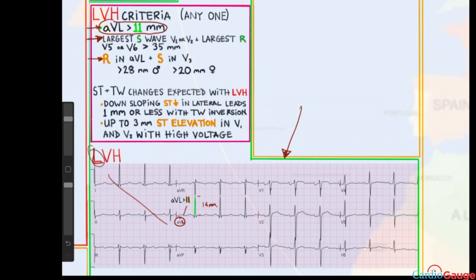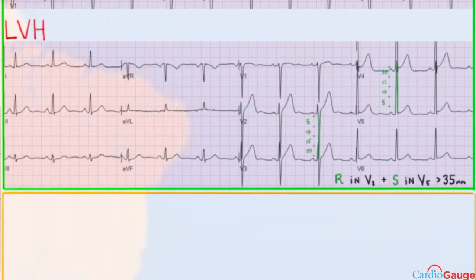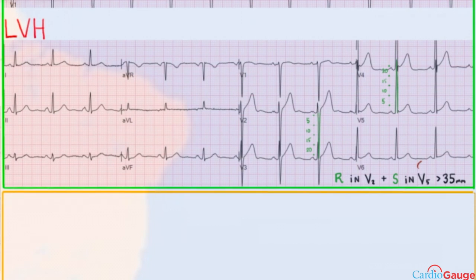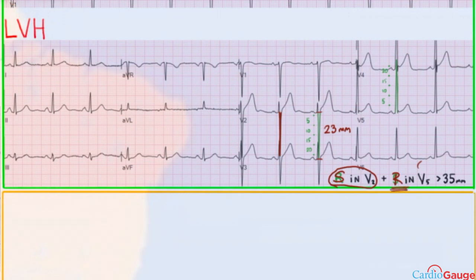The second criterion: the largest S wave in V1 or V2 — the downstroke — plus the largest R wave in V5 or V6, if those two added together are greater than 35 millimeters. Note there was a typo on screen; it should be S and R respectively. The largest S wave in V2 is about 23 millimeters, and the largest R wave in V5 is about 28 millimeters. Those add together to 51 millimeters, which is clearly greater than 35. So this is an LVH EKG.